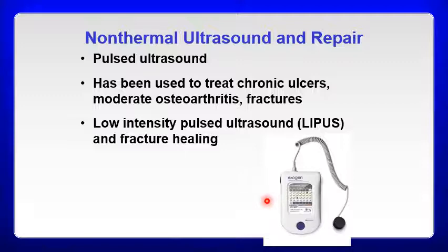And the theory is that this low-intensity pulsed ultrasound can help with fracture healing. So there's some additional research that still needs to be done on that. At this point, I don't think it's yet a mainstream treatment, but it is something getting looked at in regards to fracture healing and ultrasound.